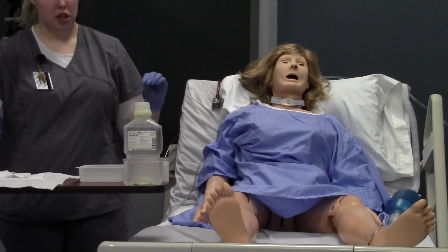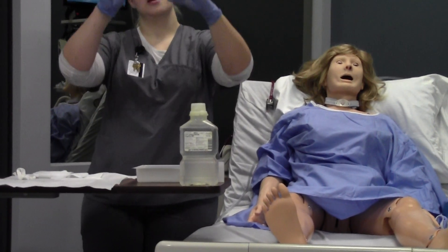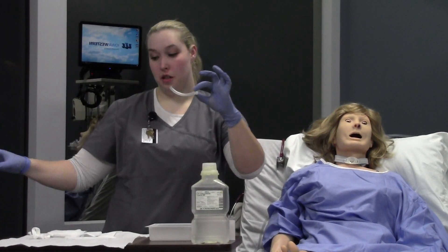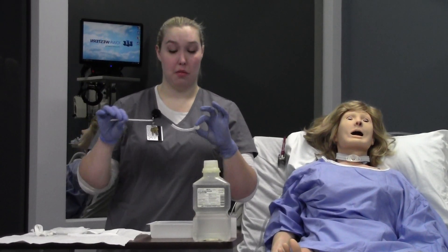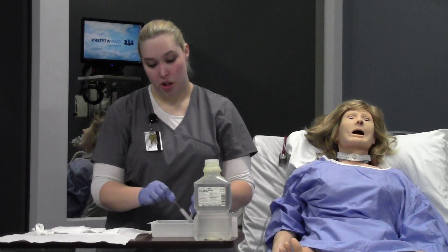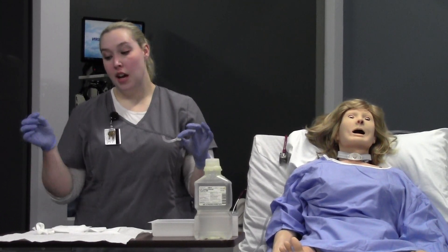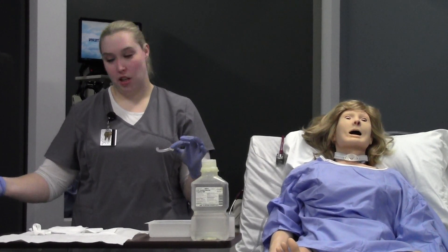I've put it into our solution. With my sterile hand, I'm going to get my pipe cleaner and clean the inside of the cannula. I need to be careful not to insert the pipe cleaner too far, otherwise I could break sterile field by touching myself or the outside part of the cannula — just the inside part, then throw away. Never put anything back on the sterile field; everything will be broken and you'll have to start completely over. I'll clean the inside again and throw away. Then I'll use my little brush to clean the outside — make sure everything looks good.